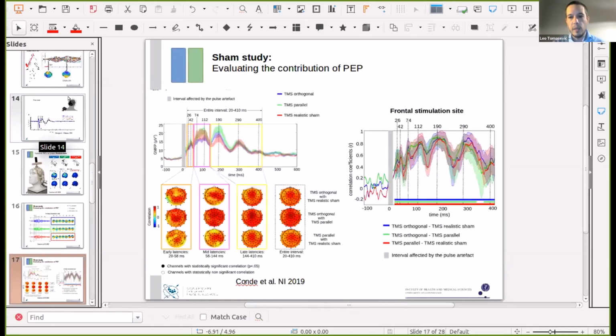With this same study, we also performed various correlation methods to see how much the signals were correlating, and we saw that the major part of the correlation was in the central, a little bit more central frontal electrodes, which are those that we have seen also as those that mainly represent the auditory and the sensory stimulation.